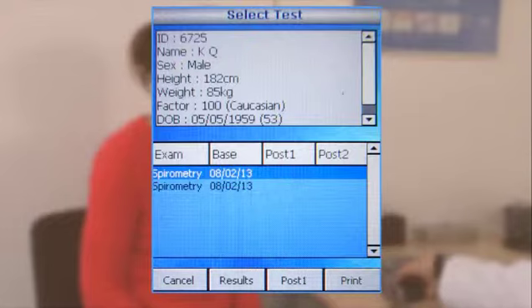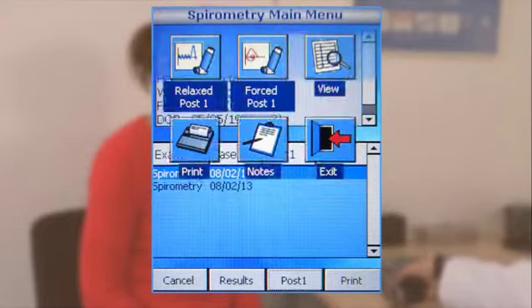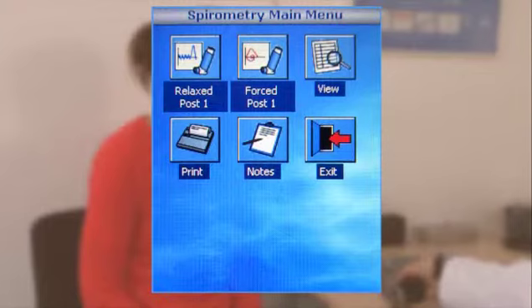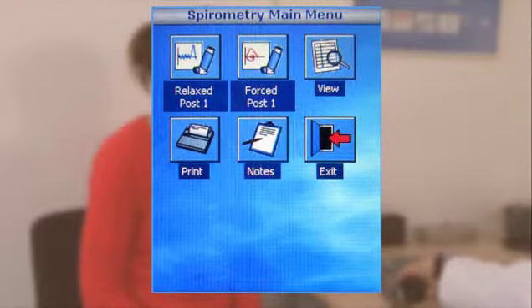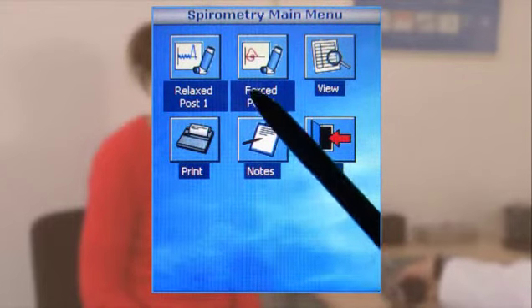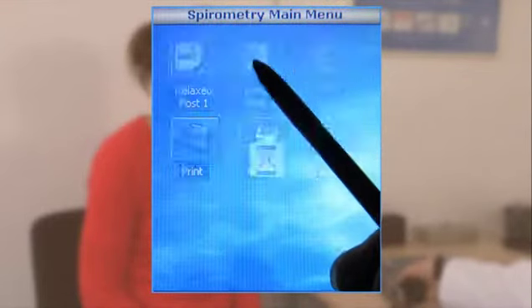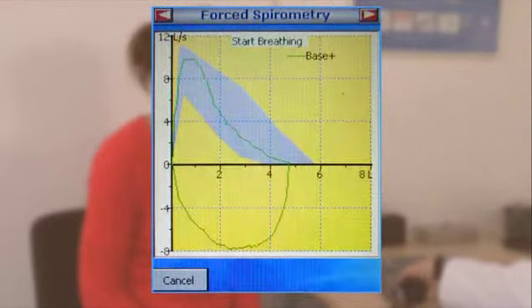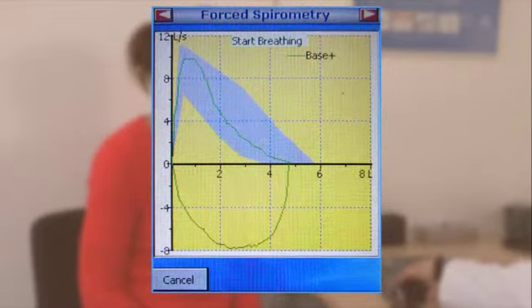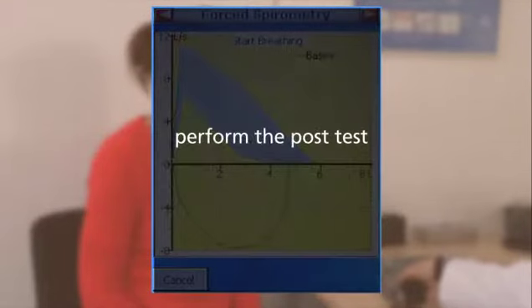Select the latest examination and click Post 1 to start a post-test for this examination. In the Spirometry main menu, select the type of post-test you want and then perform it.